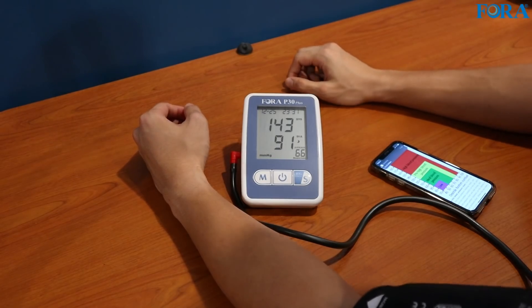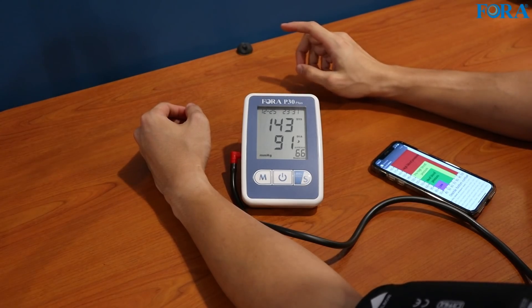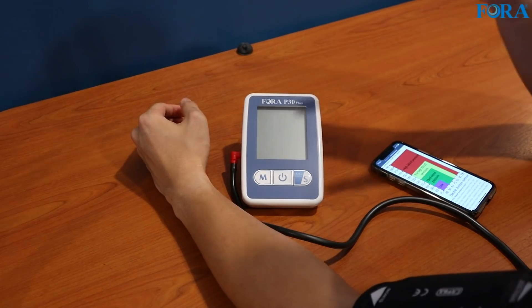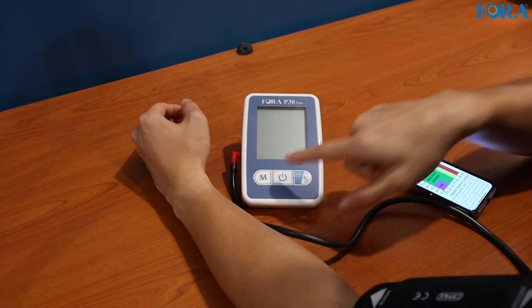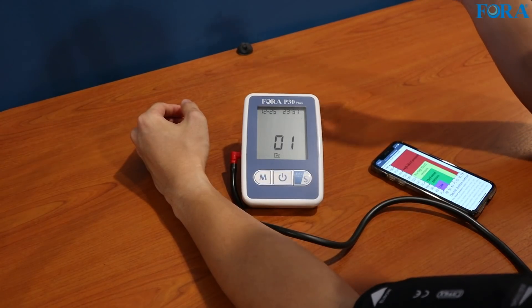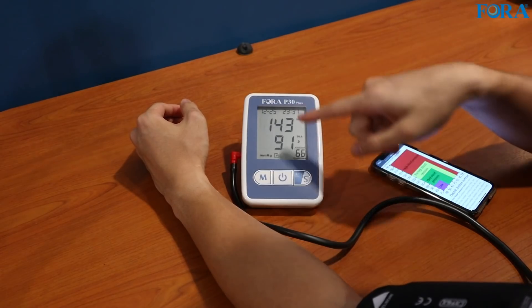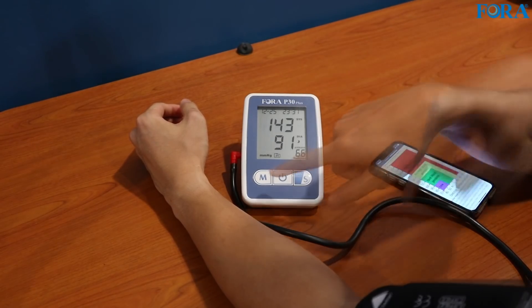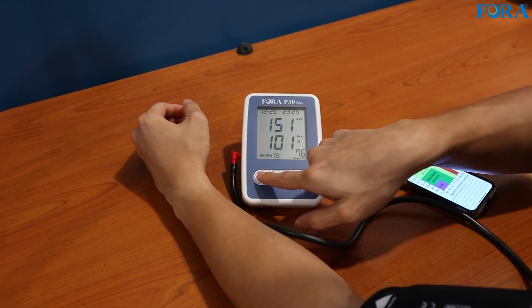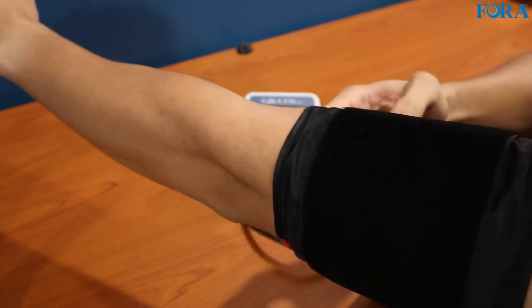I think the number went down a bit. We can check that by going into the memory — let's have a look at the results I just did. In order to look back at the memory, you have to hold the M button and it will take you to the history of readings. Number one is the most recent reading. 143/91 — and then just press it again for the reading before that. With the single button you scroll through the readings. It's very simple.